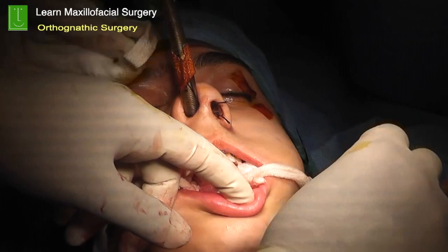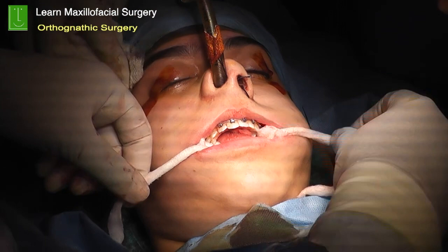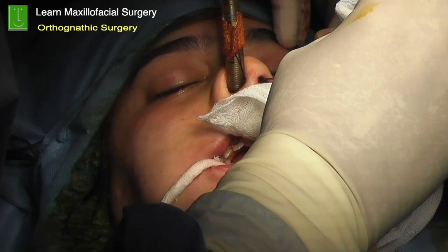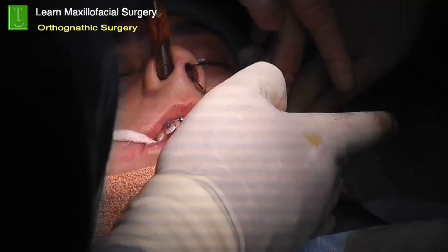There shouldn't be any major complications when you do a SAG. Also a good idea to basically apply some hydrocortisone to the lip. The very fact that you've stretched the entire lips and cheek, you are bound to expect a significant amount of edema in the post-op phase. So using hydrocortisone to the lips and to the cheek really helps in trying to minimize the amount of bruising and swelling which is there.